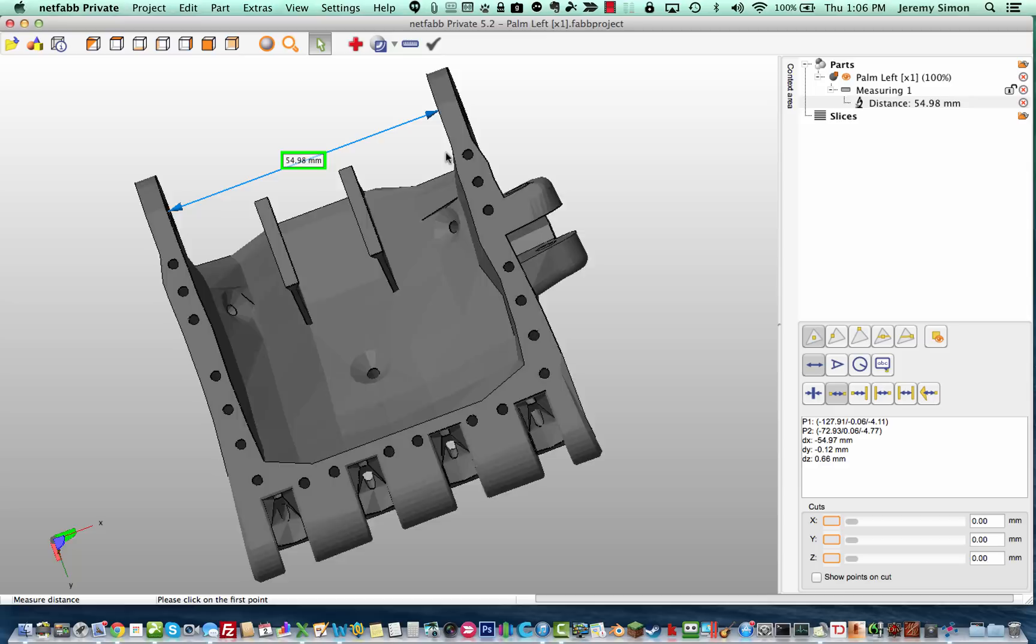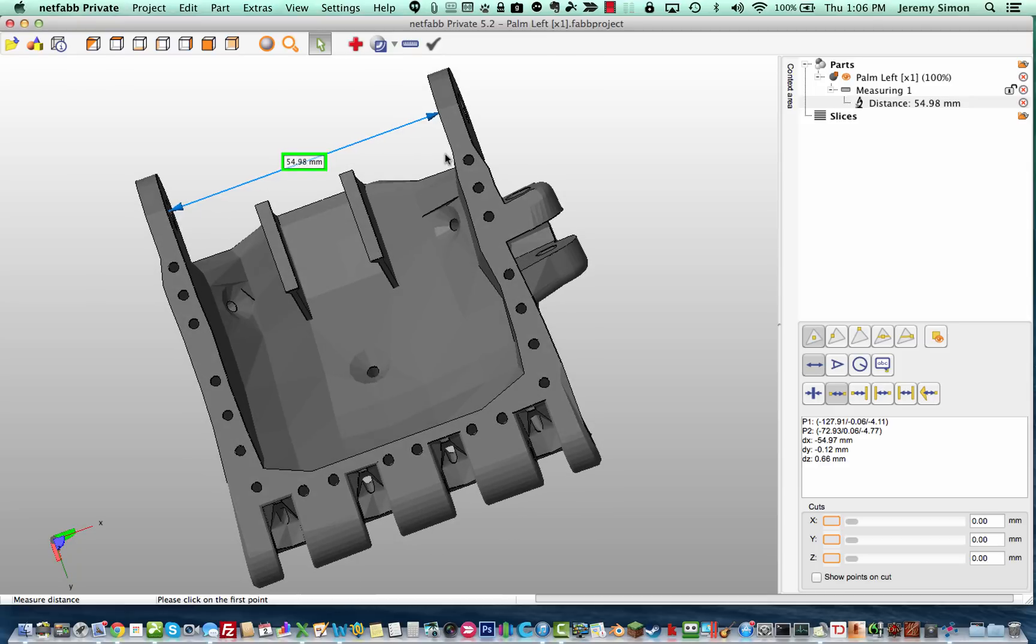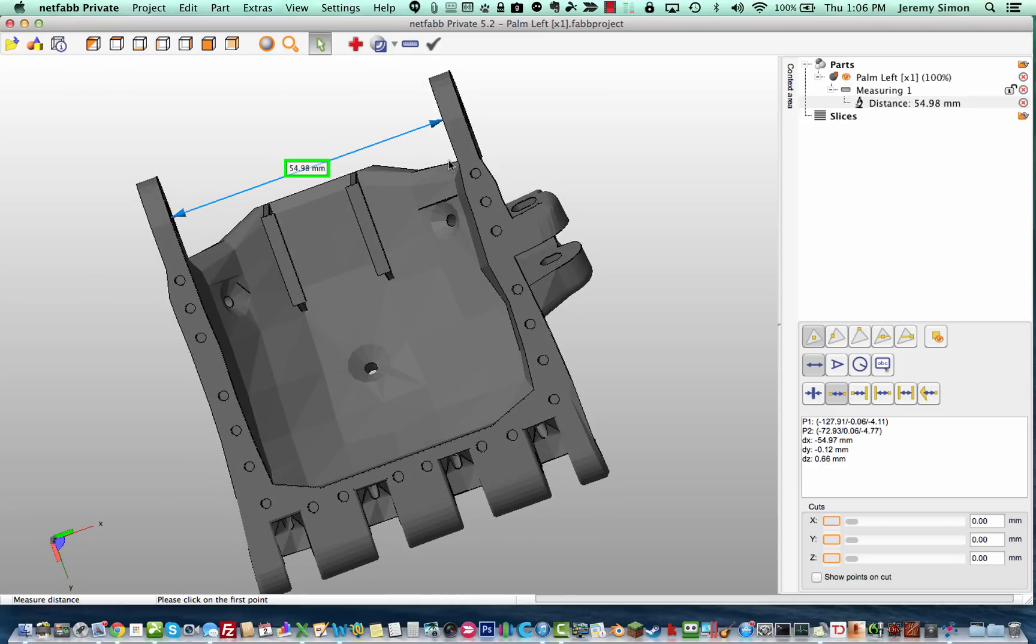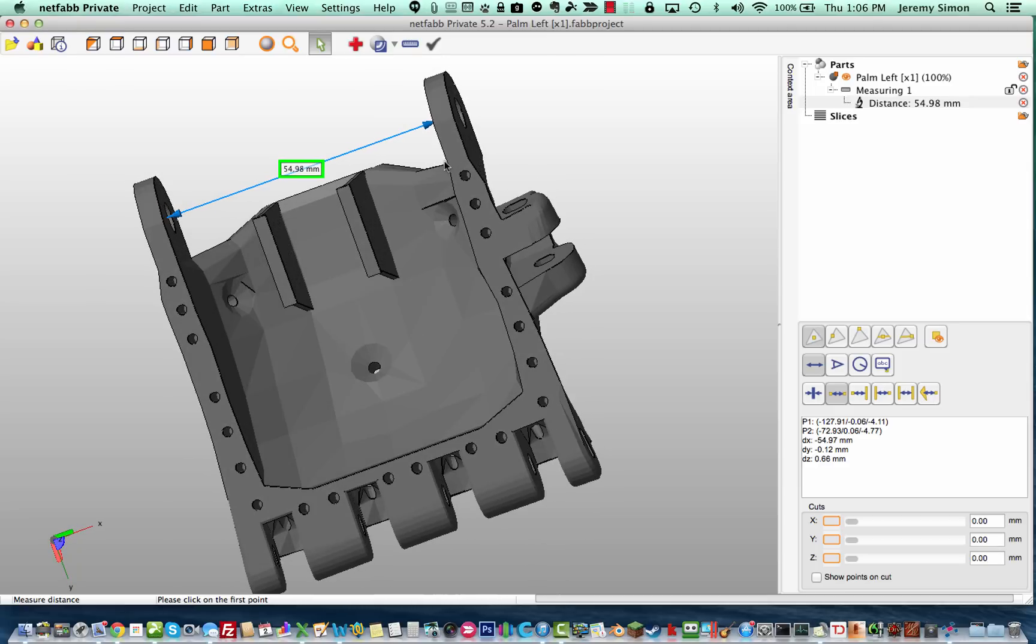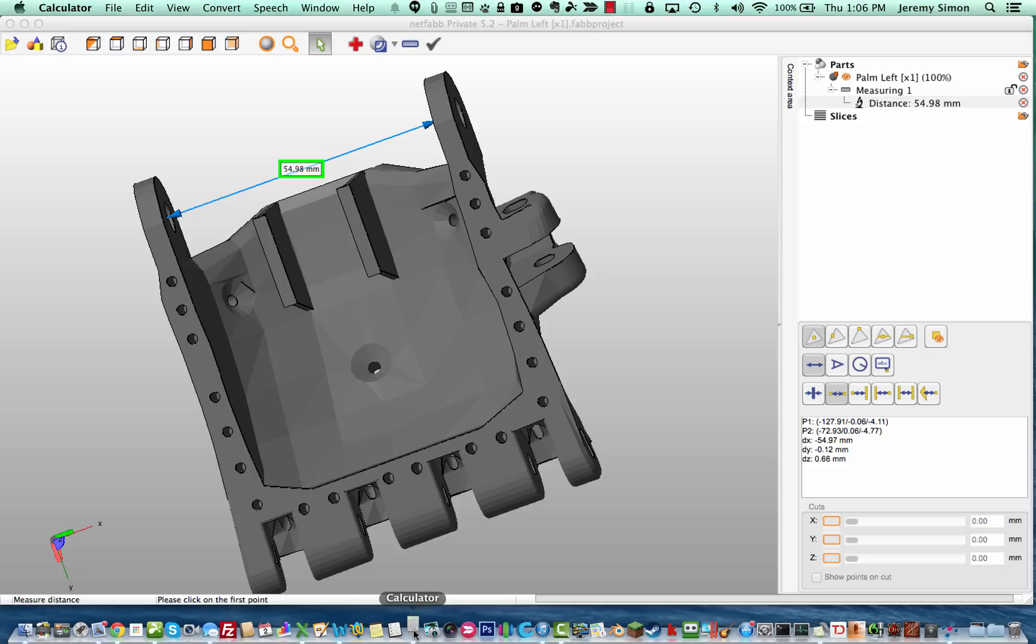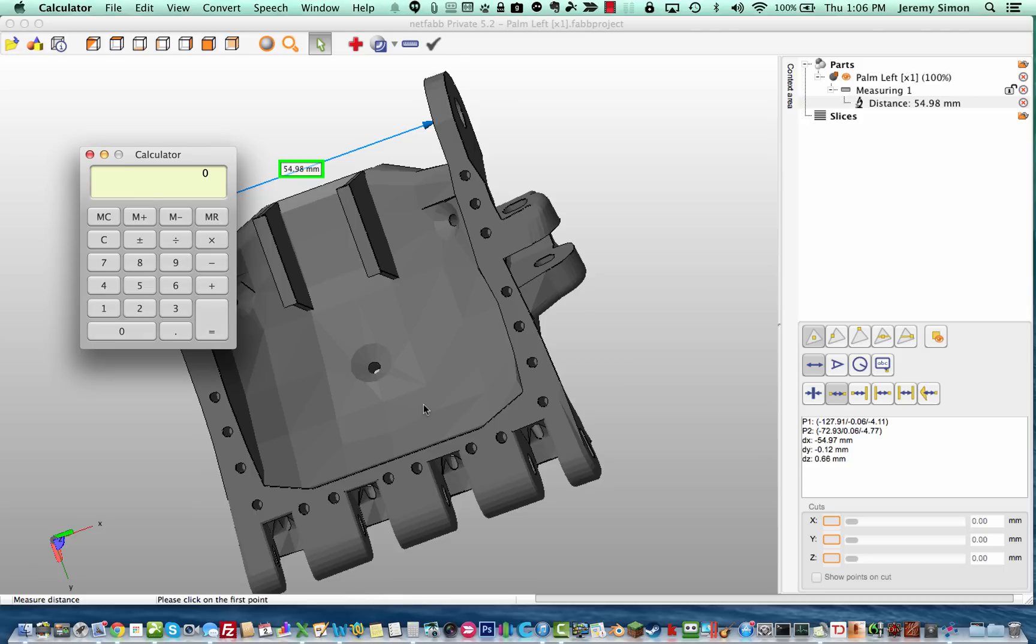So if I wanted to scale this for somebody who has a width of, say, 60 millimeters, we usually add, say, 5 millimeters to account for padding and velcro and such, we would go ahead and divide. So I'll take 65 divided by 55, which is the measurement that we got from our model.